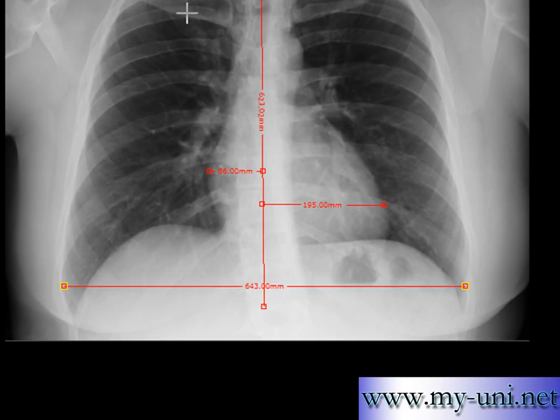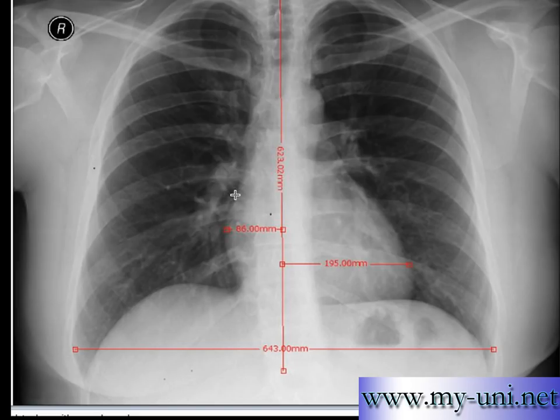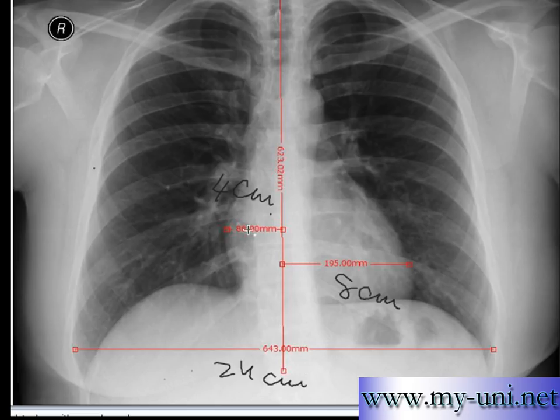Unfortunately, the calibration on my computer is not right to measure the exact numbers, but we can make assumptions. For the sake of simplicity, we'll assume that the right-side measurement was 4 centimeters, the left-side measurement was 8 centimeters, and the total thoracic width was 24 centimeters. So 4 plus 8 is 12 — 12 centimeters is the transverse diameter of the heart, and 24 centimeters is the maximum width of the thoracic cavity.